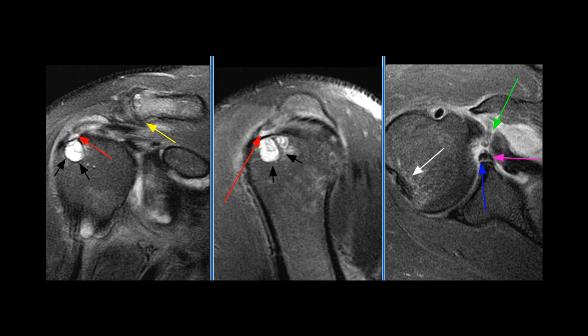This case is a 58-year-old male with issue of shoulder pain and weakness. MRI examination of the right shoulder.